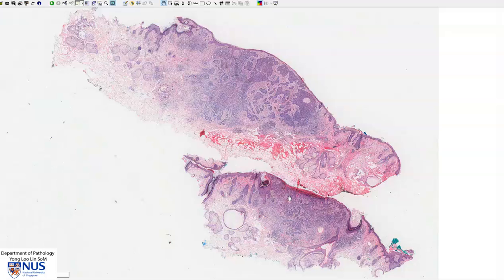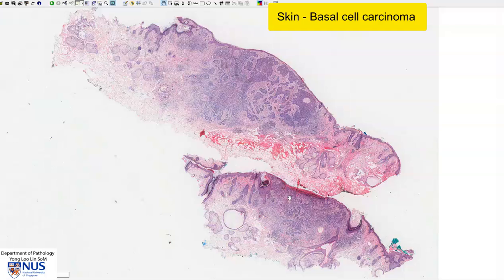Hello, this is a virtual microscopy slide from a case of basal cell carcinoma of the skin and we are seeing here two sections from the tumour.